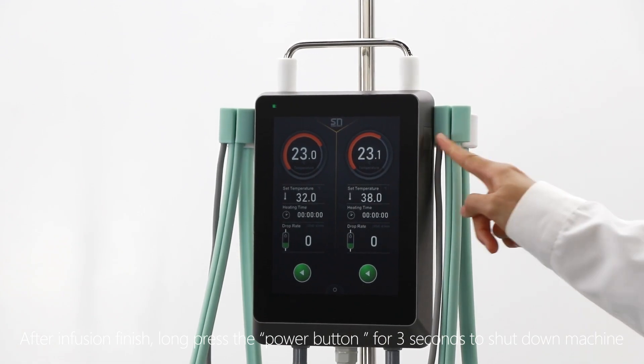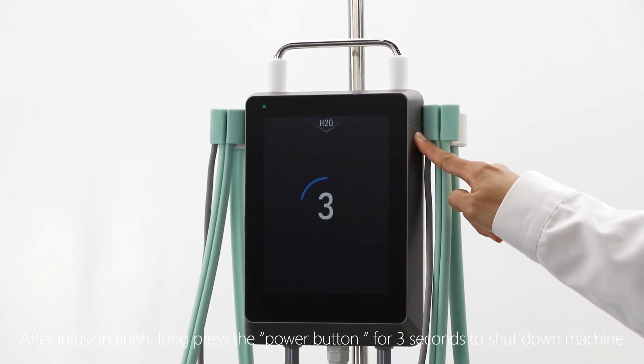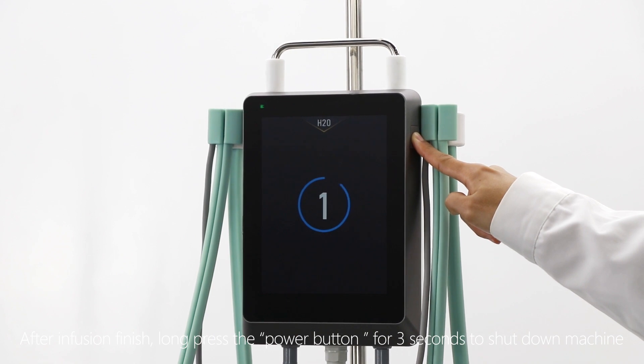After the infusion is finished, press the power button for 3 seconds to shut down the machine.